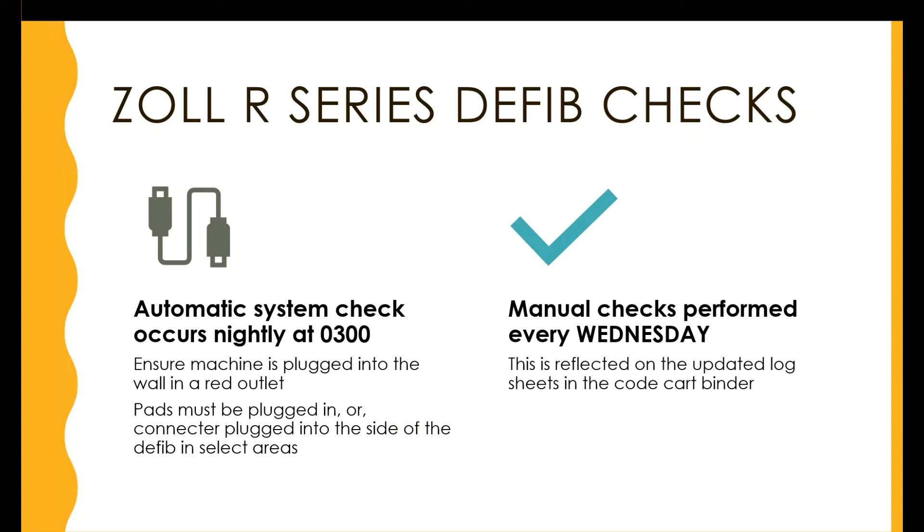The Zoll R Series defibs perform an automatic system check at 3 a.m. every day. Ensure that the machine is plugged into the wall into a red outlet. Also ensure that the pads are plugged in, or that the connector is plugged into the side of the defib in select areas.